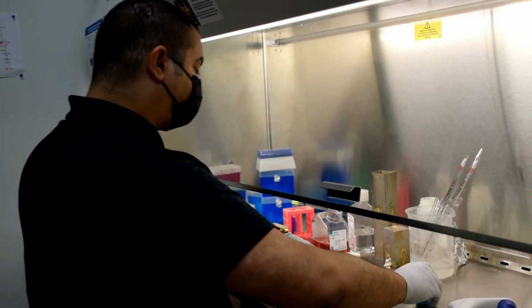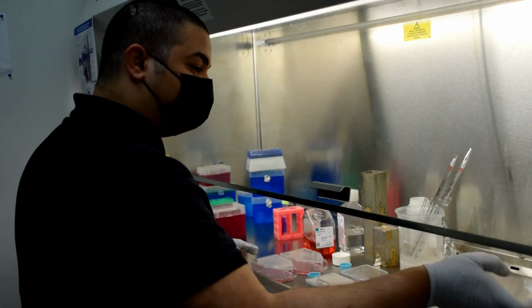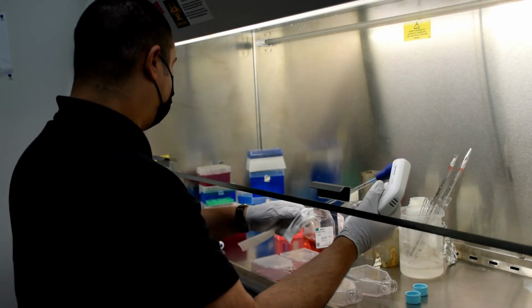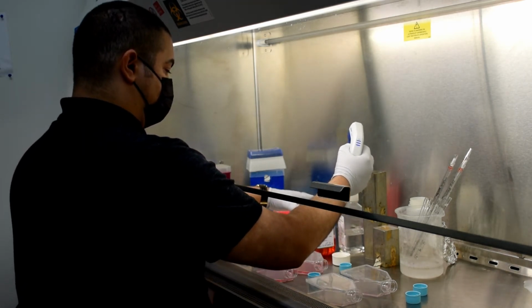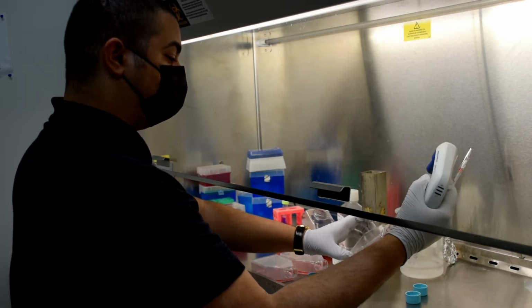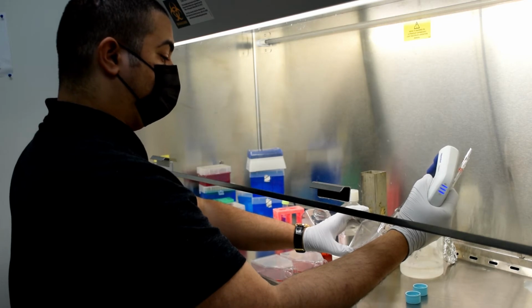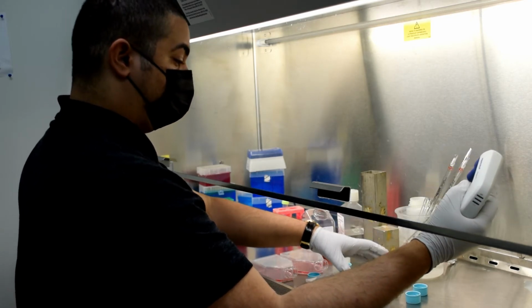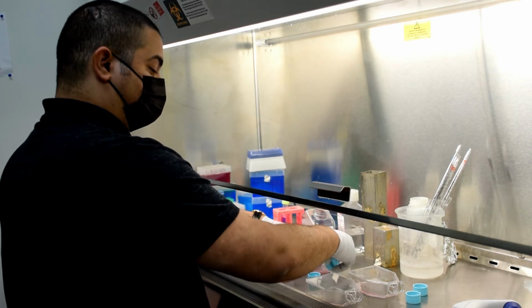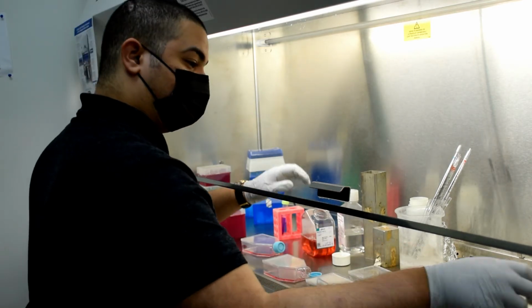So now that the cells are ready, we want to transfer the cells from the old flask to the newer flask, and we need to also use media to do this. Around 2 mils of the media is appropriate, and you dump it on the cells and keep aspirating on and off for a little while until you decide to transfer an amount of the cells to the newer flask. Make sure to spread the cells around the flask, and you repeat the same thing with the other.